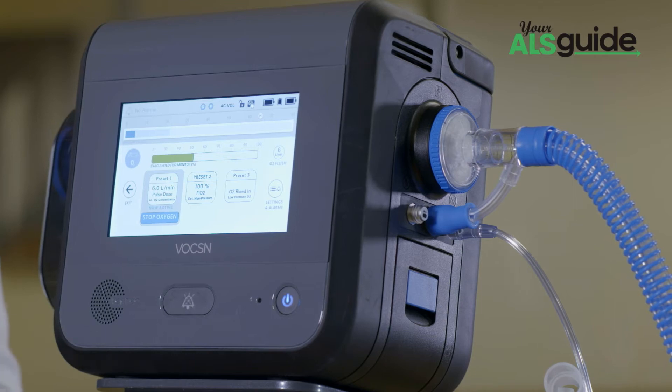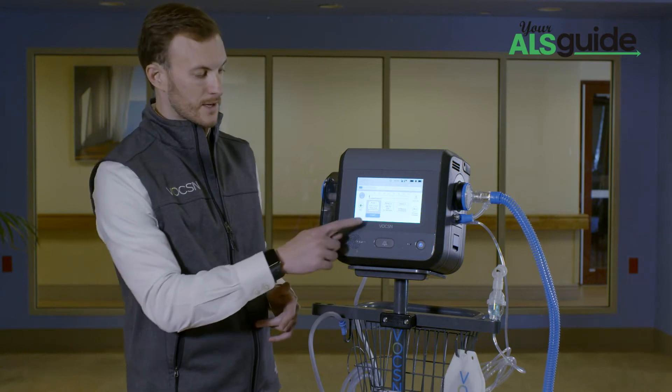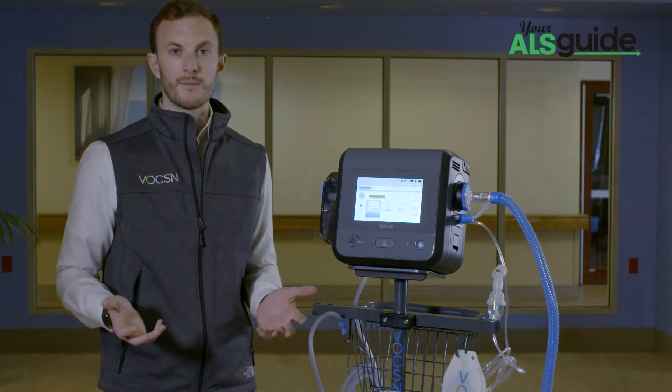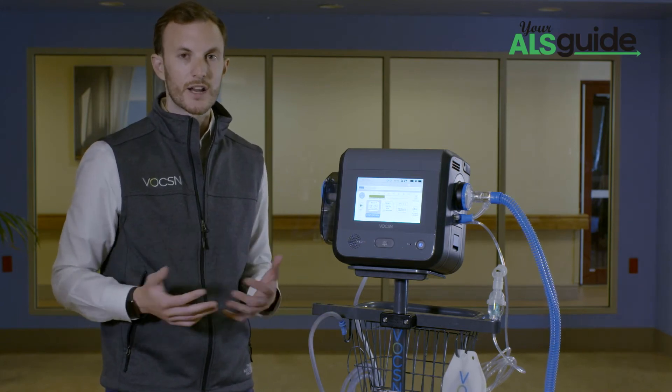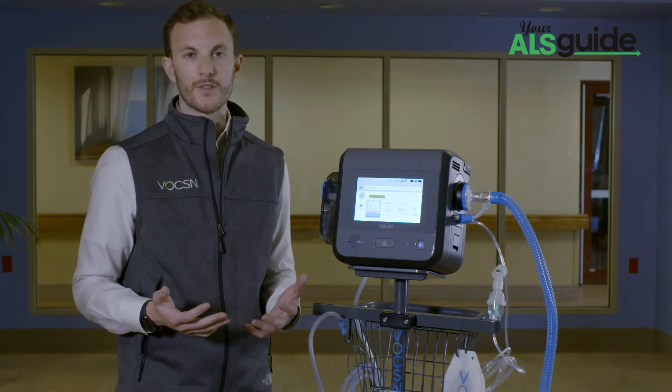I'm going to go ahead and turn on preset number one, which I have set to my six liters equivalent on my internal concentrator. I'm going to press start, and the first thing you notice is that I'm not yelling at you. Voxxin is significantly quieter than any other stationary or portable concentrator out there today.